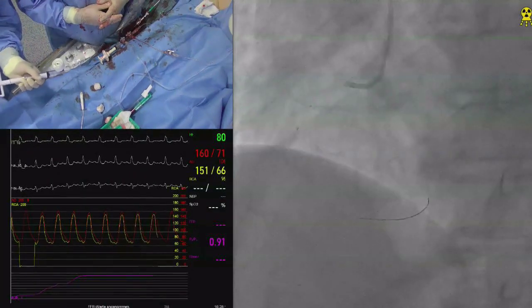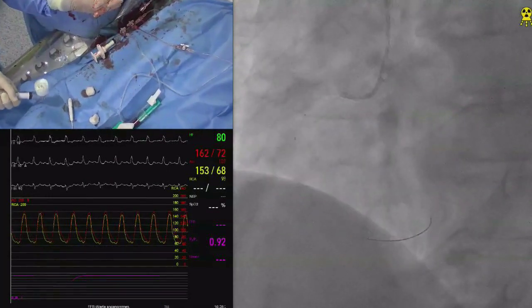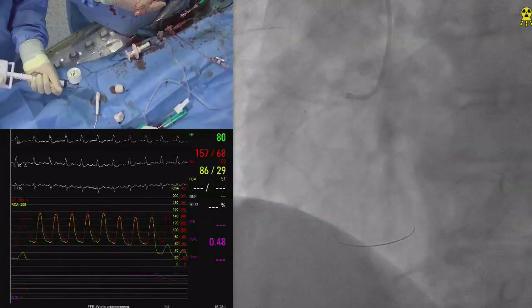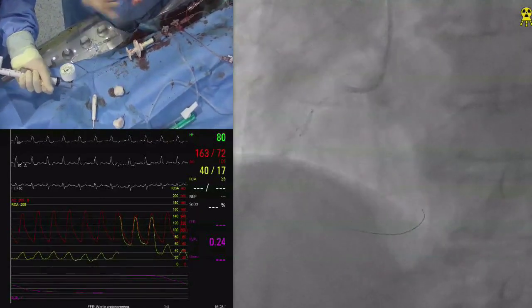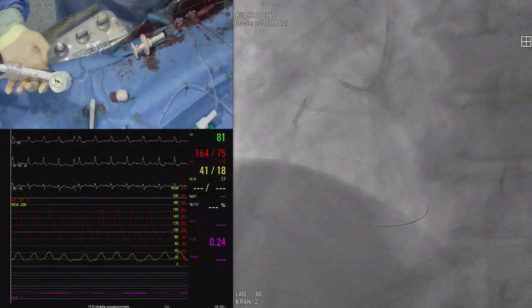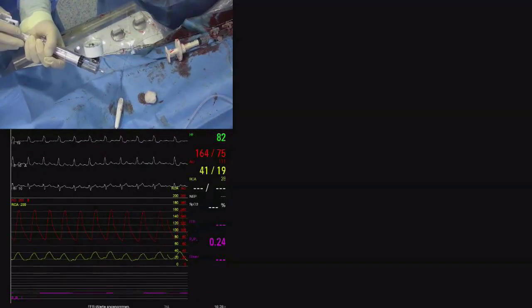One up. Okay. In my experience, usually this pressure is going to be around 20. How far up do you want to go? No, let's just go to 12, actually. You can go even higher because it's non-compliant. Just go for 16, I guess, and we crack the lesion. All right, we're at 16. So this is exactly what Gruntzig showed in his first angioplasty.